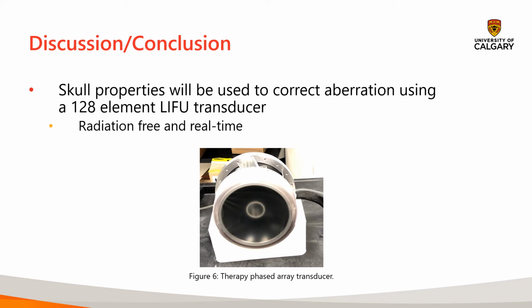intensity focused ultrasound phased array, which can be seen in Figure 6. This method will enable neurostimulation of cortical and subcortical targets in human volunteers with no radiation exposure and with real-time aberration correction.